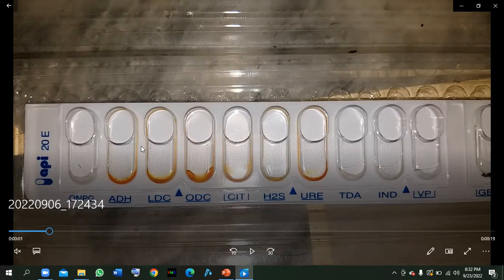Now what do these lines mean? This line means that after that you have to add immersion oil. First we fill up to here, and then we fill the remaining part with immersion oil, just to provide an anaerobic environment to the chemical reaction. And for citrate, it means you have to fill the entire well with your inoculum up to here.